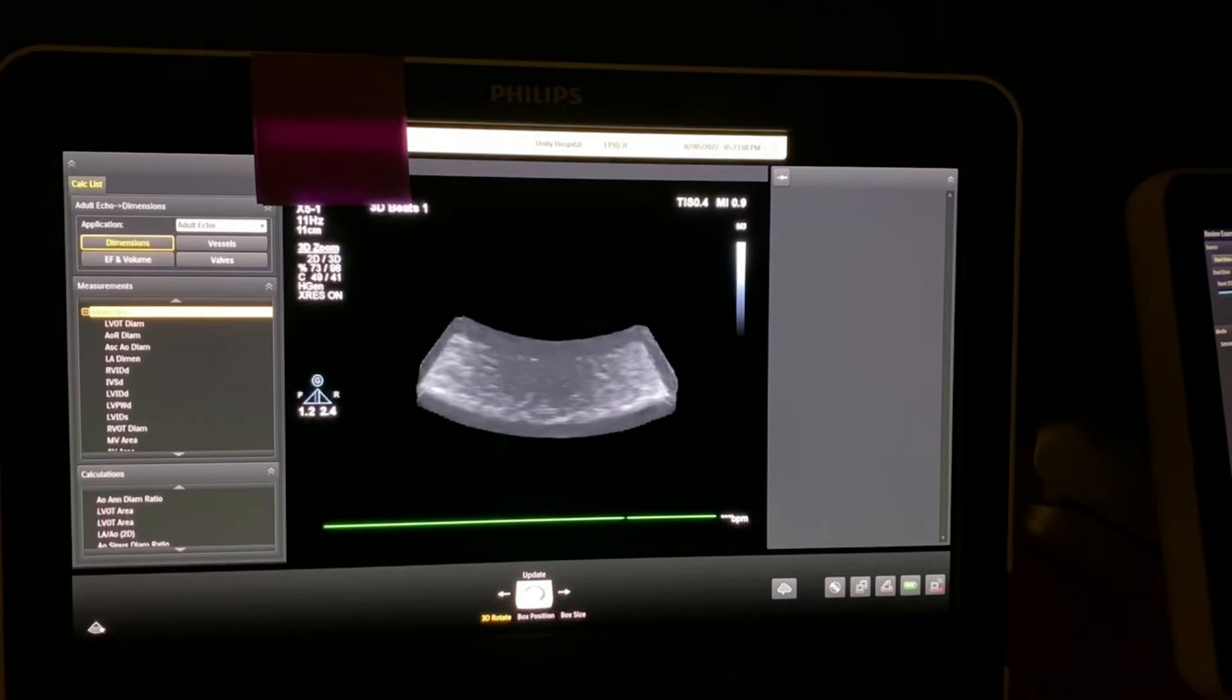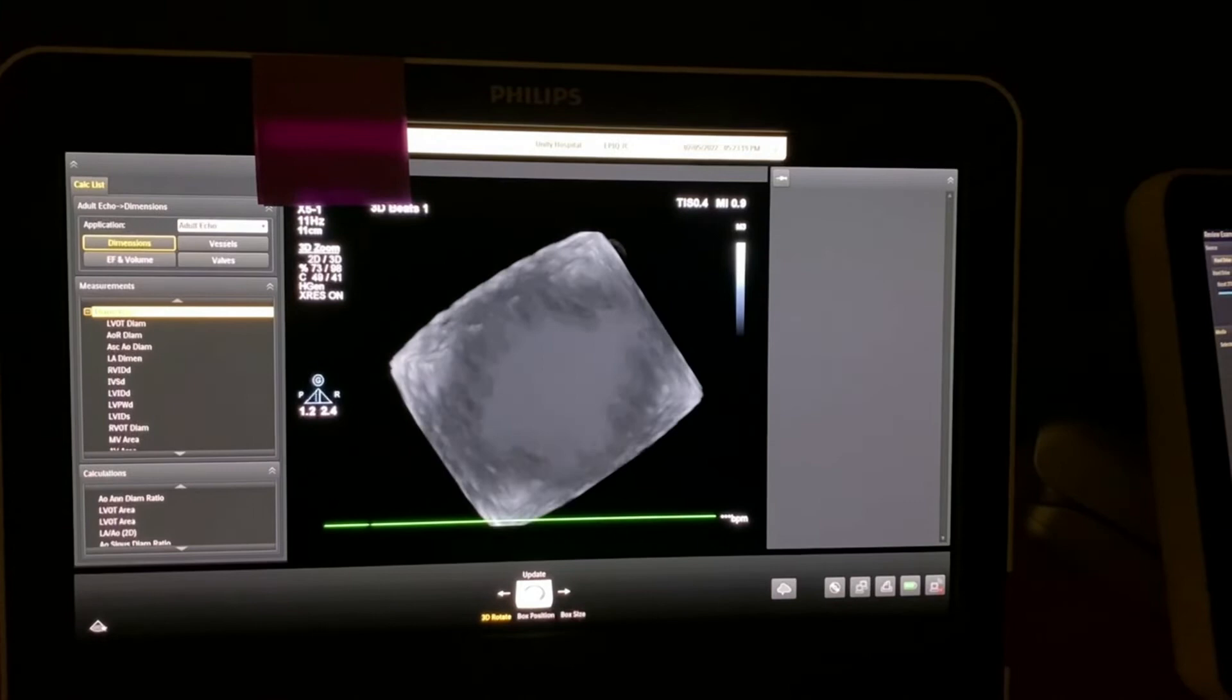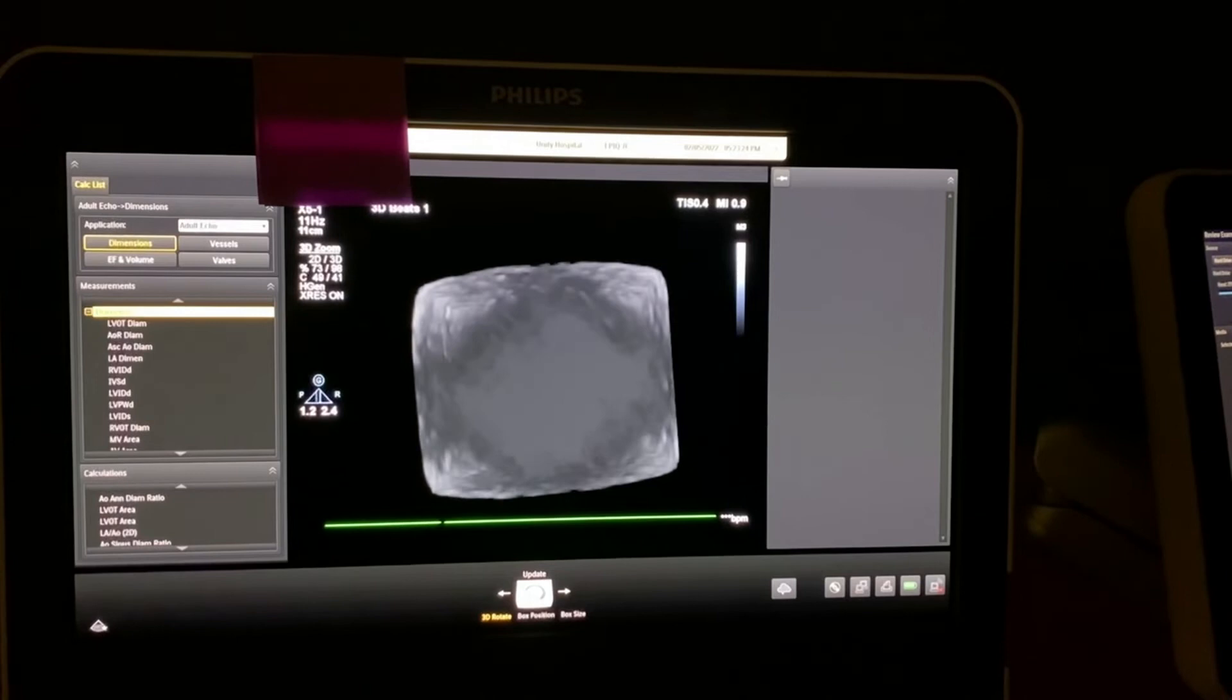Now if you roll the ball towards you, it allows you to see the mitral valve on FAS. And then the middle upper knob, you're going to rotate the aorta to 12 o'clock and that gives us the surgeon's view.